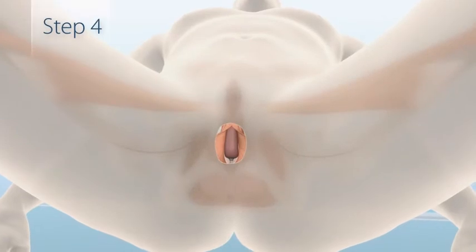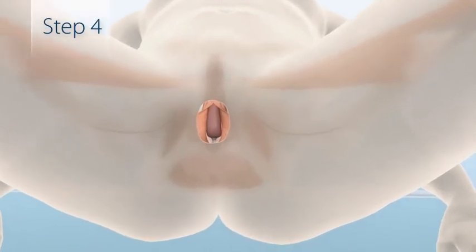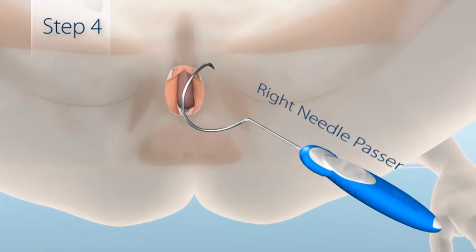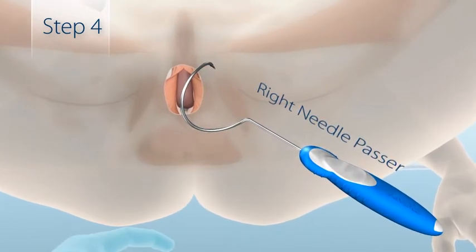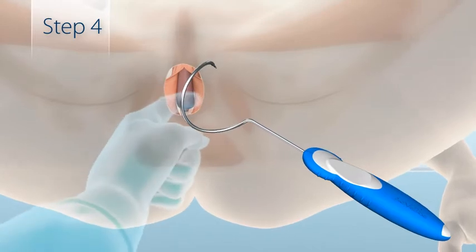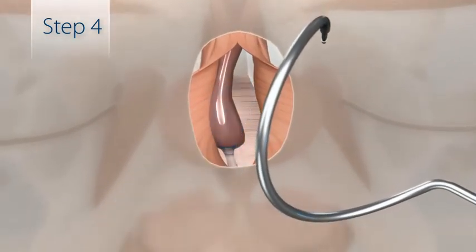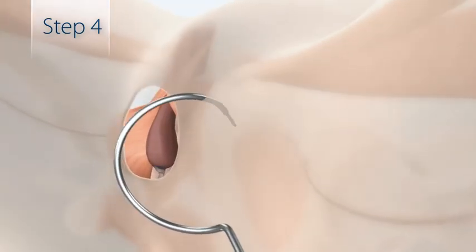The first step in sling placement is to insert the AdVance needle passer. To insert, hold the needle passer at a 45-degree angle. Place a finger of the opposite hand into the perineal incision to receive the needle and protect the urethra. Insert the needle tip straight through the obturator foramen.